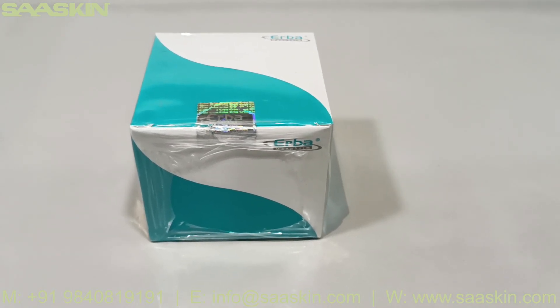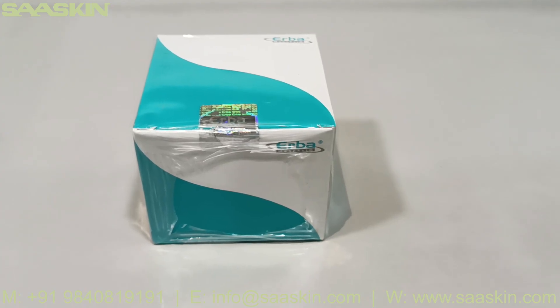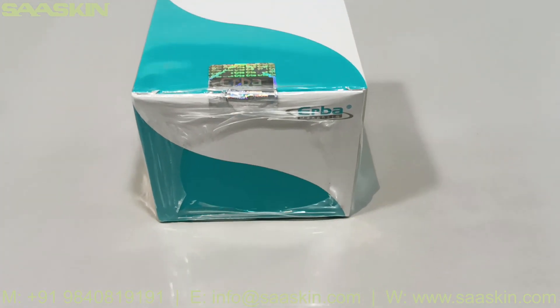Hello everybody, today we are going to see Erba Mannheim's HDL cholesterol kit. You can see this is the front and the top side view of the kit.